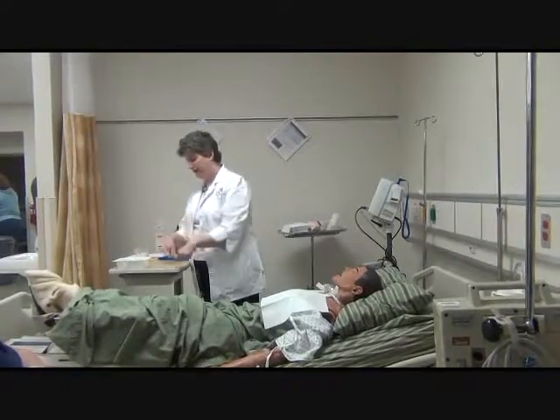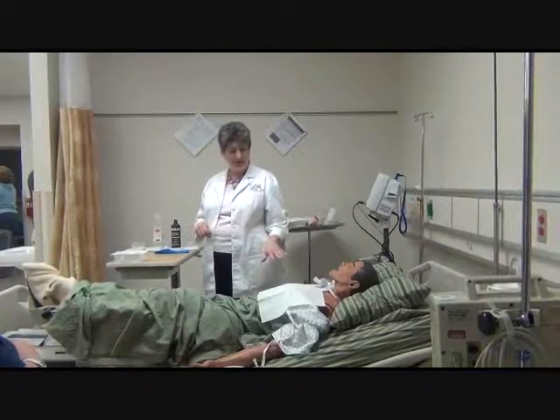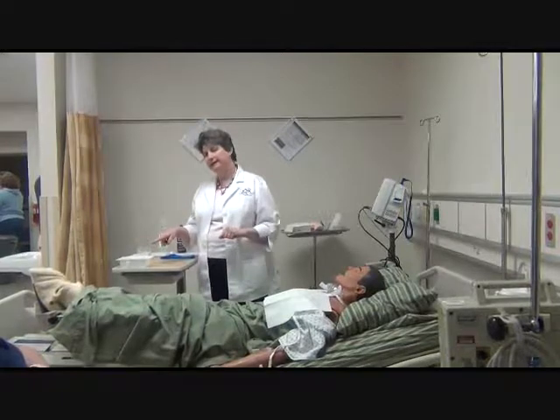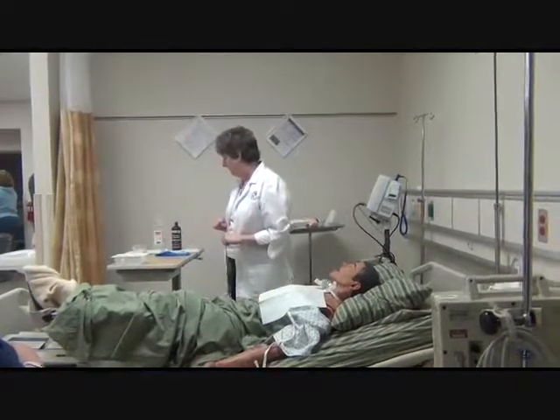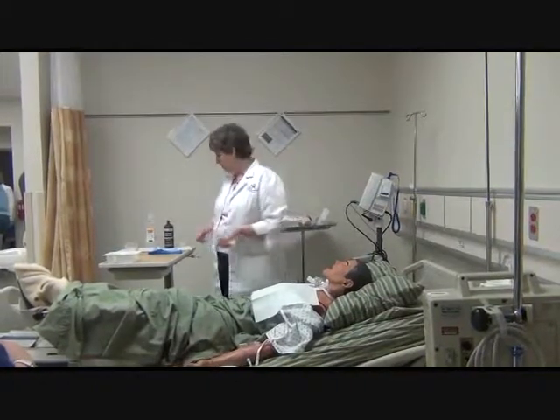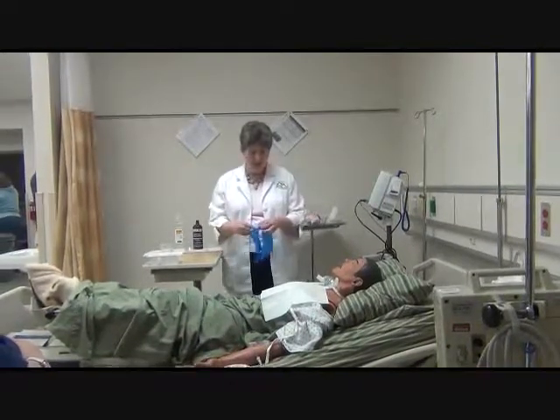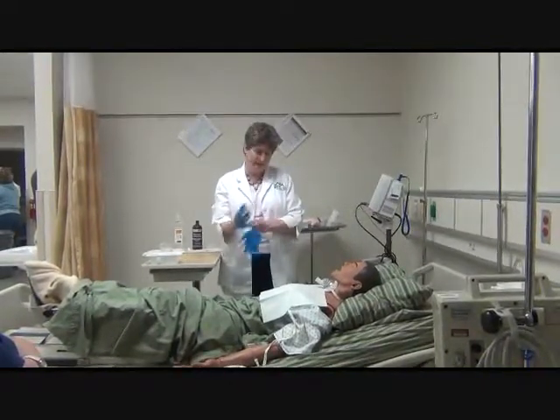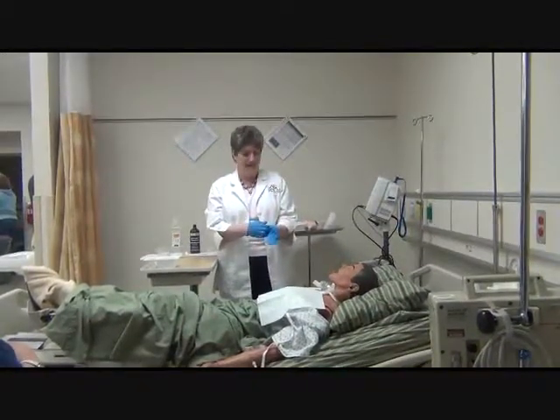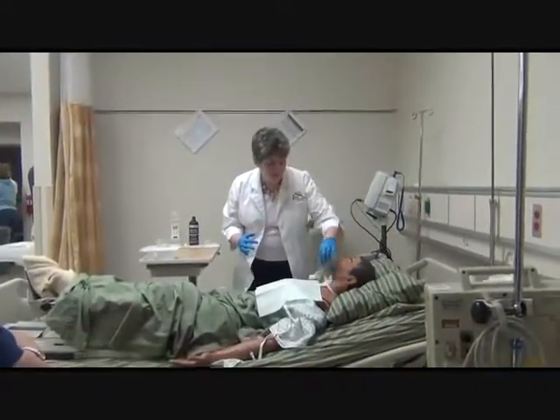So I've opened up my kit and put on the sterile drape. I want to be able to get to this stuff to do this. However, I also want to get those old bandages off, so I'm going to put on just a pair of clean gloves. Explain to my patient what I'm doing, and again, assess the need for it. I'm going to pull this off.